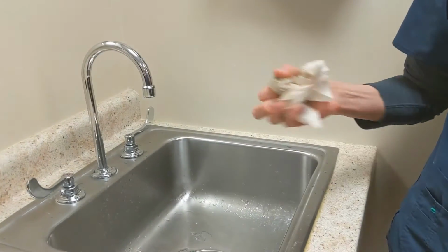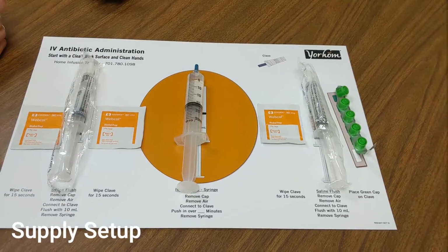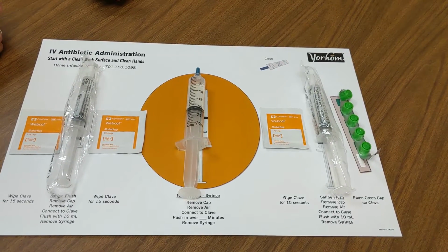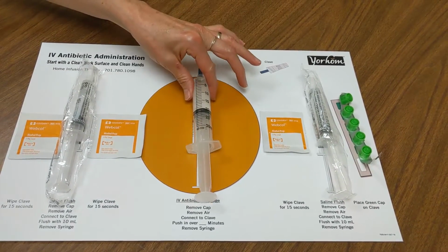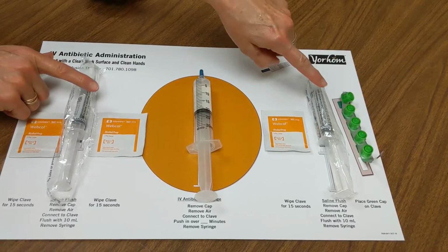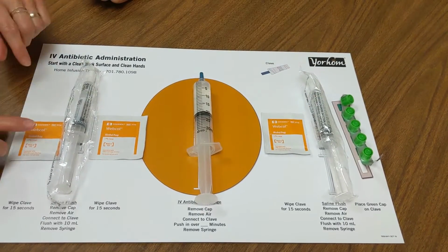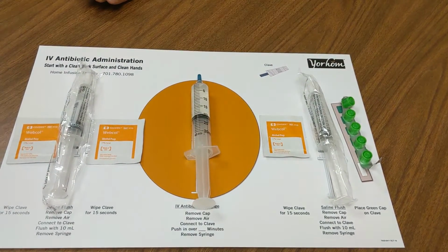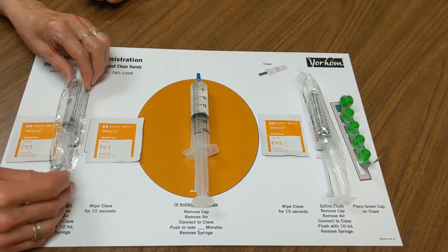Next, make sure you have all of your supplies ready to go on your teaching mat. You will need your medication syringe, 2 pre-filled saline syringes, alcohol swabs, and an alcohol protective cap. Remove all the wrappers from the saline syringes.